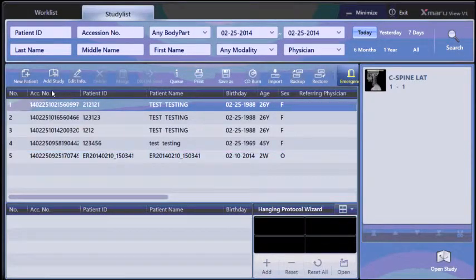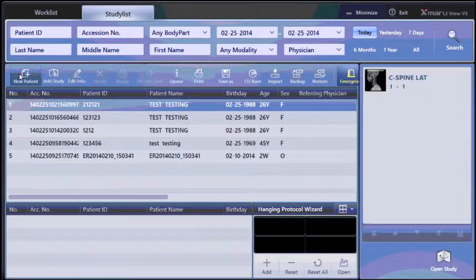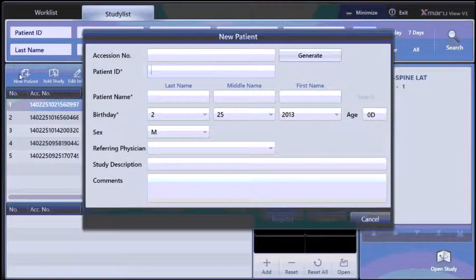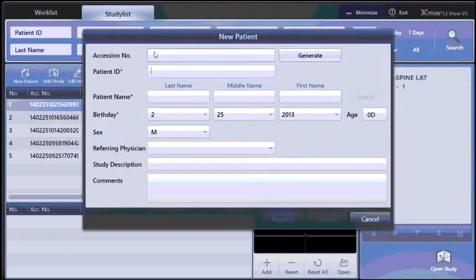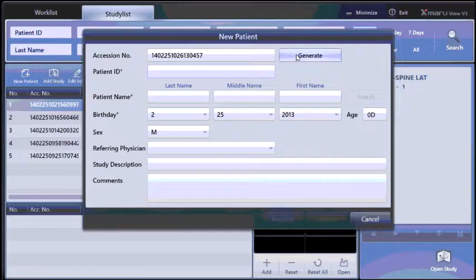Choose new patient in the upper left corner. If you do not use accession numbers, one can be generated for you.